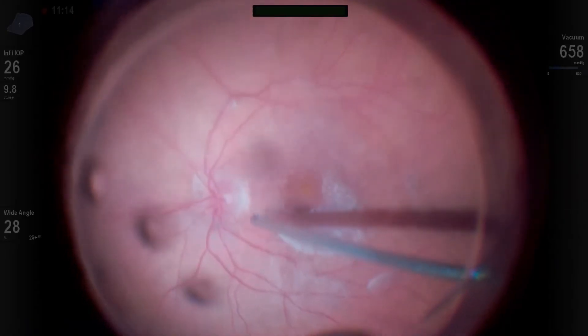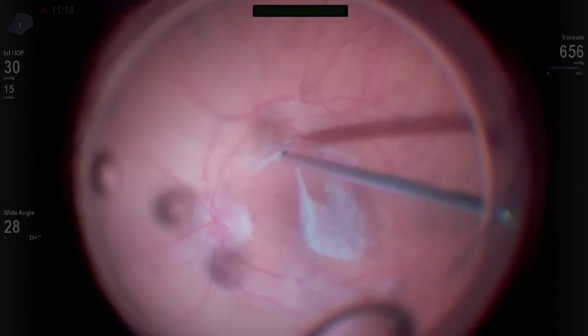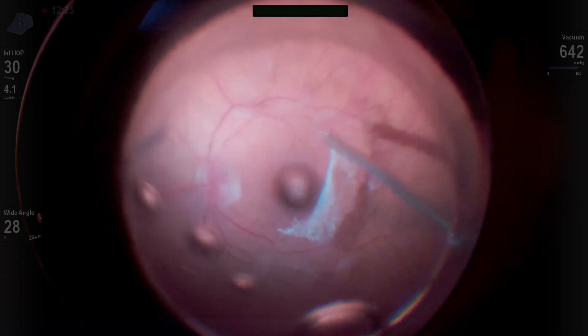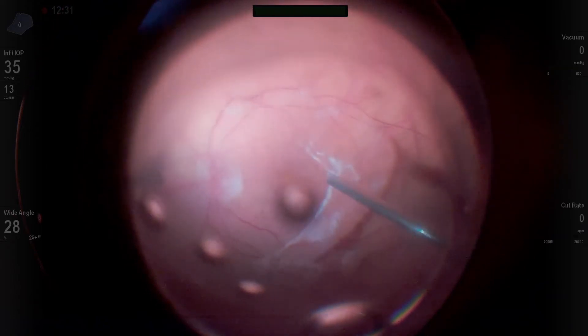Now I can go back and grab inside that defect with my cutter and aspirate and peel the hyaloid anteriorly. I couldn't have done that if I didn't create some sort of defect in that vitreoretinal or vitreo-optic nerve adherence. The best and safest place to do it is at the optic nerve head.